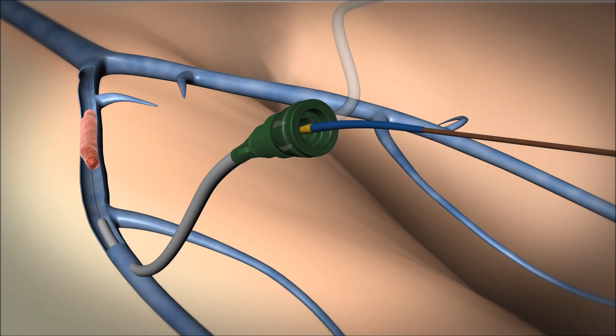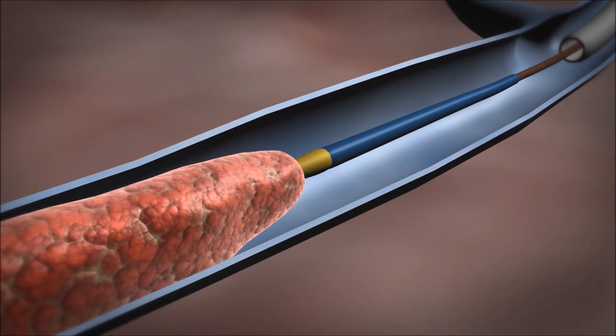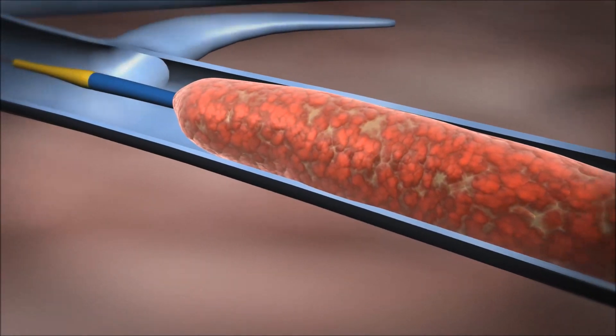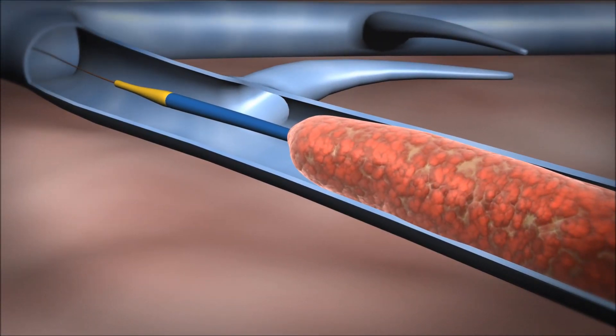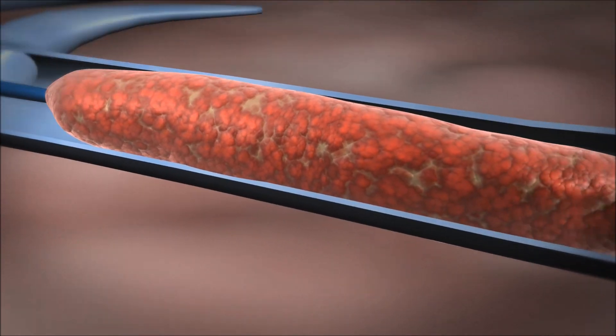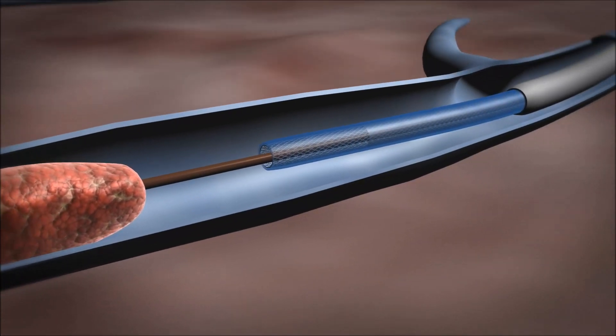The Capere delivery catheter with its atraumatic radio-opaque nose tip is inserted through the clot, and the funnel catheter is positioned proximal to the clot.